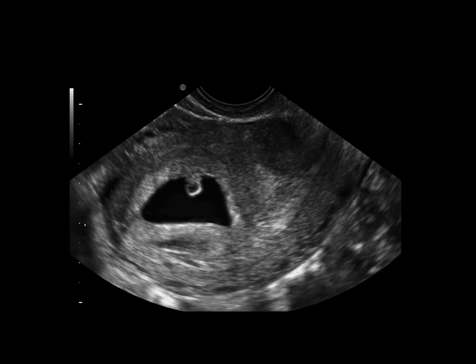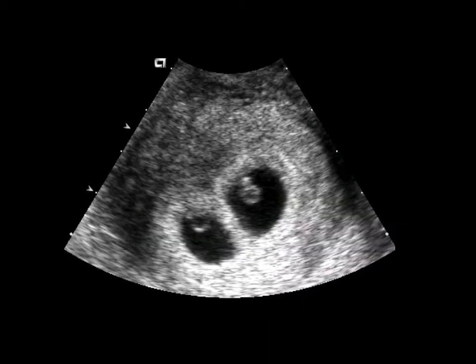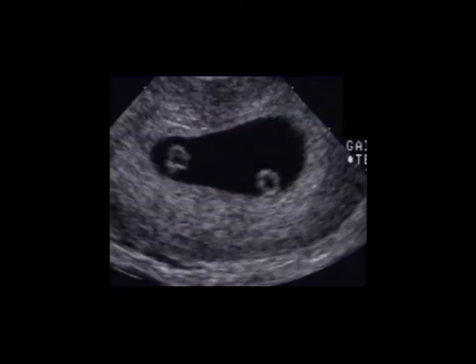So the next question you want to ask yourself is, how many babies do you see? Most of the time you will find one yolk sac or one fetal pole indicative of one intrauterine pregnancy. However, occasionally you will come across 2 or more yolk sacs, which will be a surprise to you as well as generally to the mom. So here's an example of 2 yolk sacs. So this is a patient who has twins.